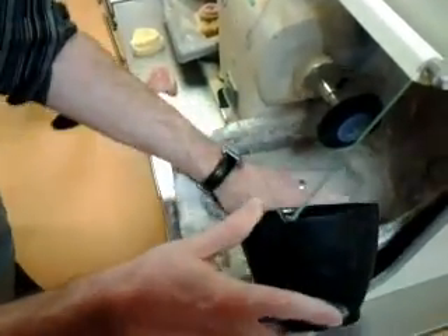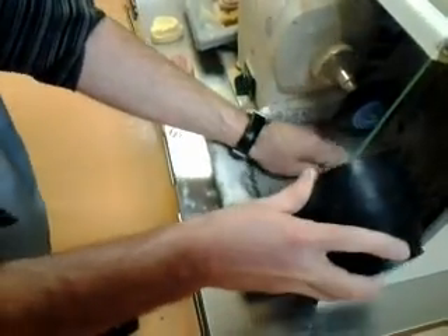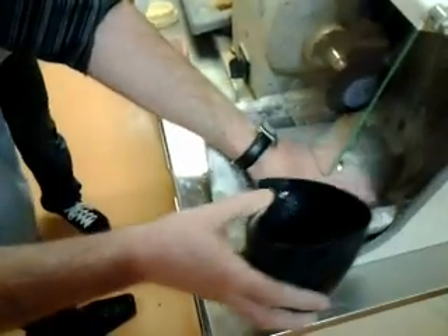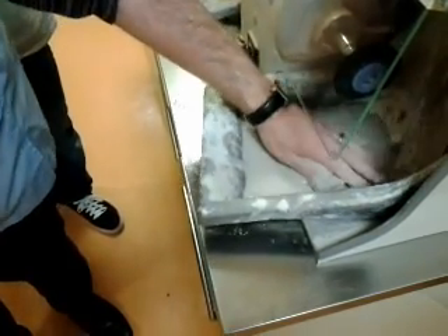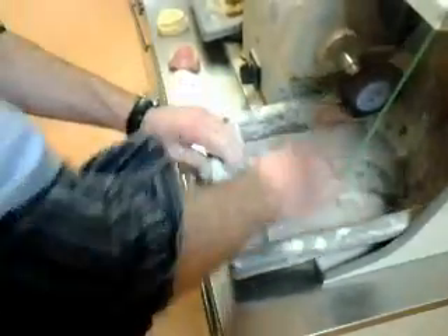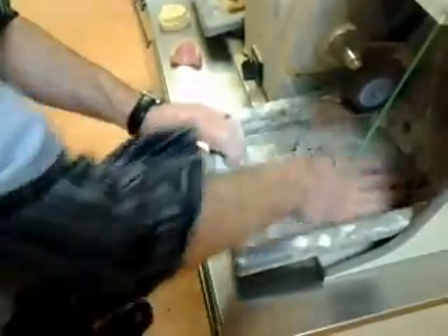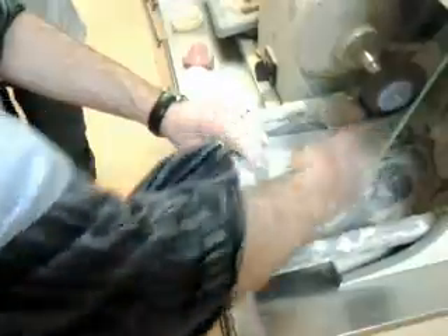A little bit more water. Ensure your pumice is nice and wet so that it forms a slurry.